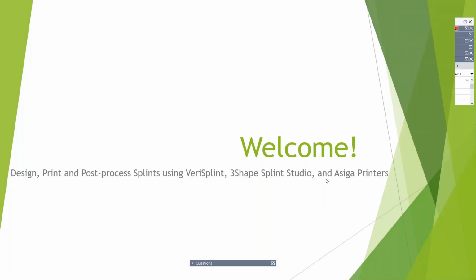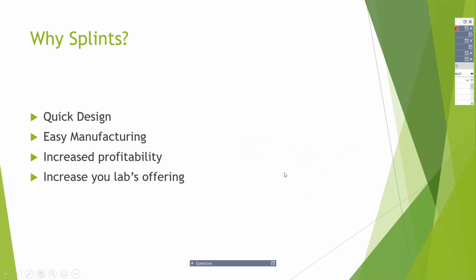First, let's talk about why splints. What can they do for you? If you're not already doing these splints, why even dive into this? And if you are doing splints analog, we can also talk about how transitioning these workflows to digital can make a big impact on your laboratory or practice.